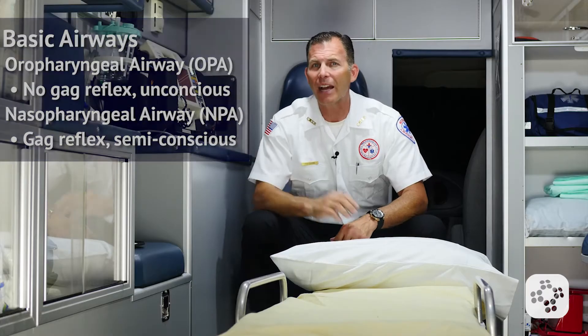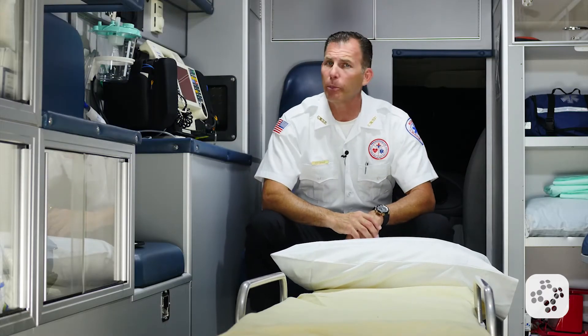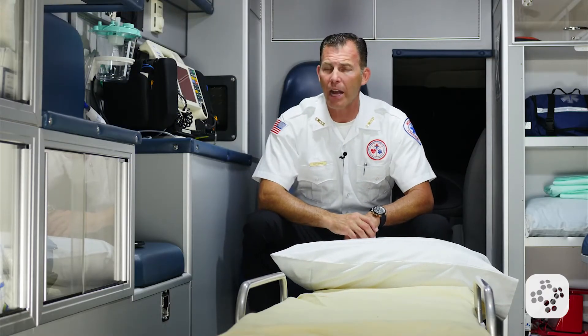The correct sizes of the OPA and NPA are very important in order to not cause further harm, or in some cases even block the airway altogether. A correct way of measuring for the OPA is to connect the tip of the flange at the corner of the patient's mouth and the base of the curved plastic to the ear lobe area of the patient.